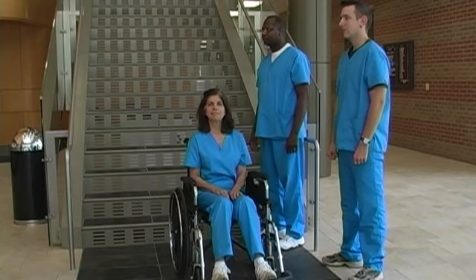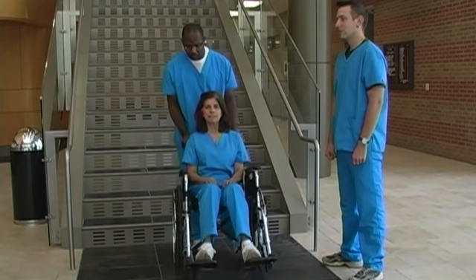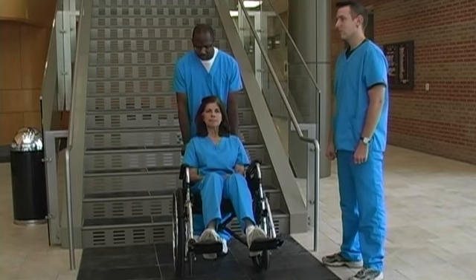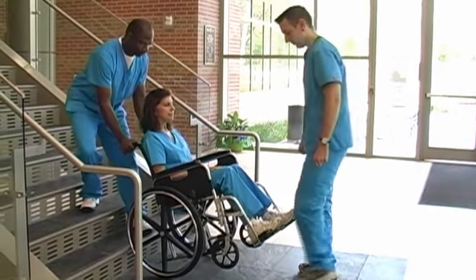One person moves behind the wheelchair, places one foot on the tilt bar, and pushes down while pulling back on the handles, tilting the wheelchair backward. That person backs the wheelchair up to the steps, while a second person grasps the wheelchair frame.